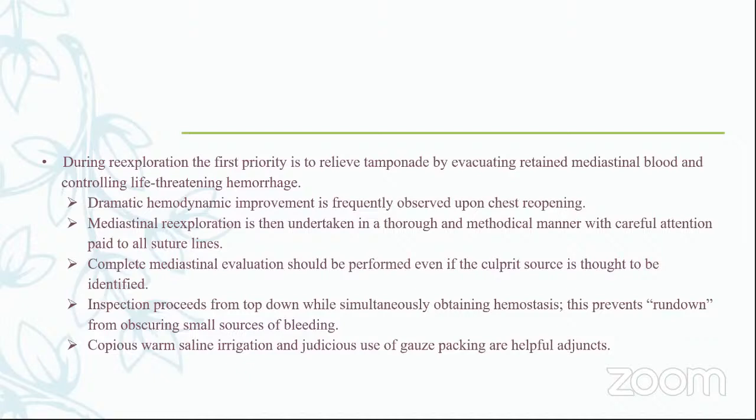Sometimes a dramatic hemodynamic improvement will be frequently observed upon chest reopening. The mediastinal re-exploration can be undertaken in a thorough and methodical manner, with careful attention paid to all suture lines. So we should evaluate the whole mediastinum even if the culprit source is thought to be identified. Inspection will be from top down while simultaneously obtaining hemostasis. And then finally, we can do copious warm saline irrigation and gauze packing, which is a helpful adjunct.